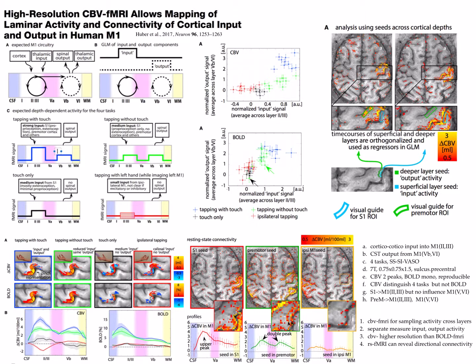So he also used the method of resting state functional MRI analysis after acquiring the data. For each subject you can have a time series, and first you see here this image.